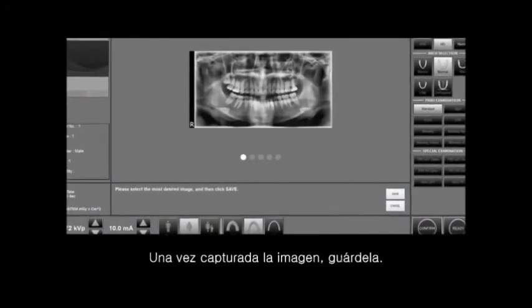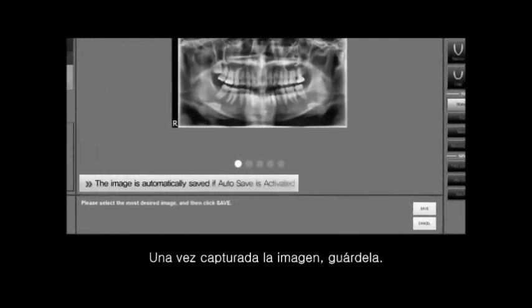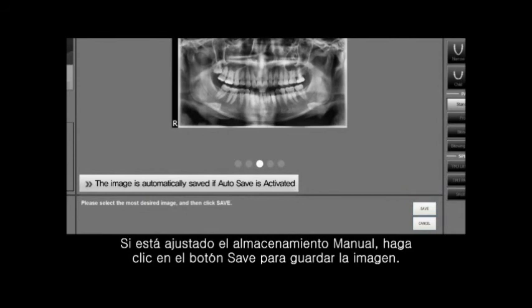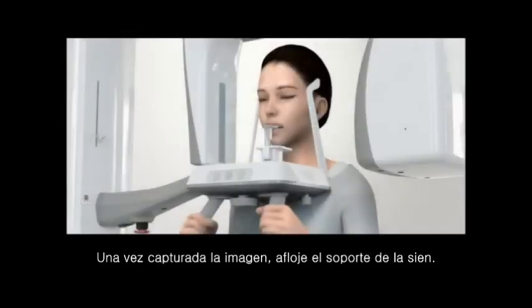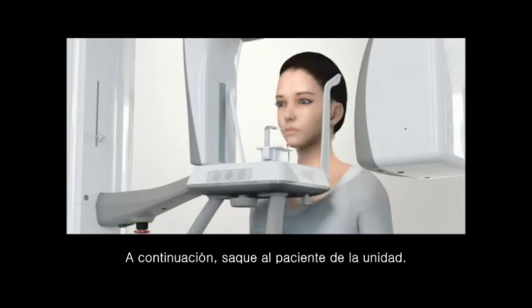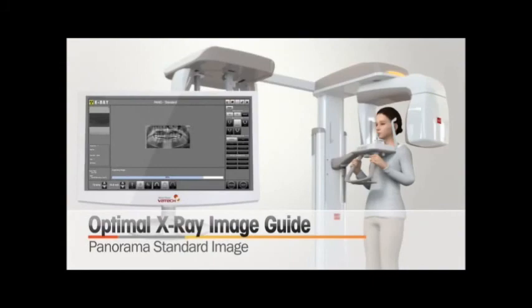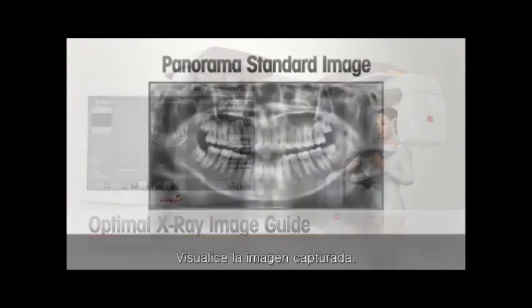After the image acquisition, save the captured image. If you purchased a license of AF mode, select and save the optimal image using the mouse wheel. If the manual save is set, click the Save button to save the image. After the image capturing, unfasten the temple support. Then guide the patient out of the unit. Check the captured image.